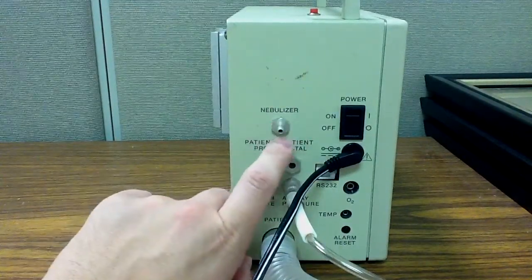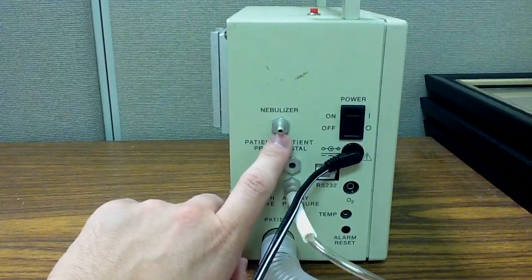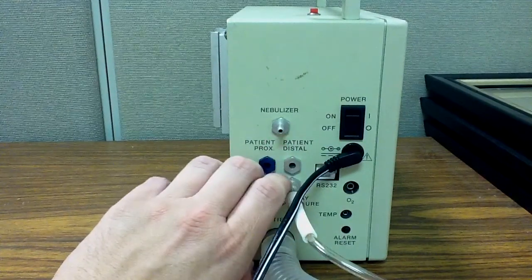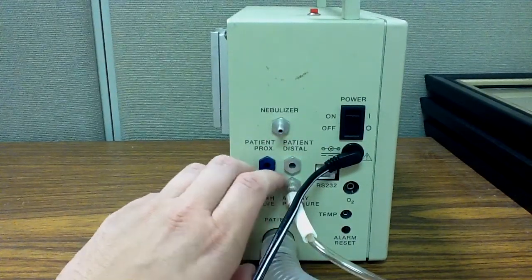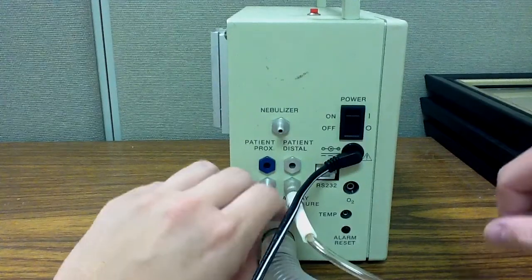So you want to be very careful about how you do that and you just want to see how the patient responds, and you may have to adjust the ventilator settings accordingly.